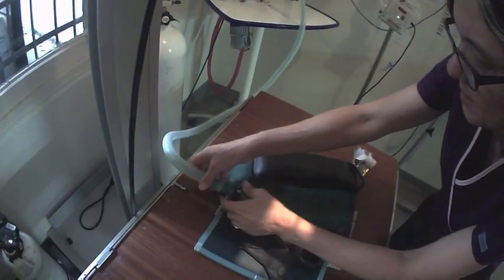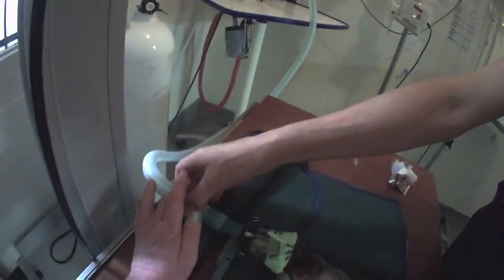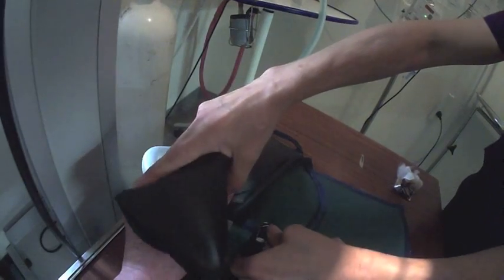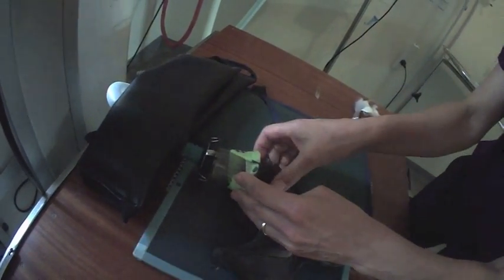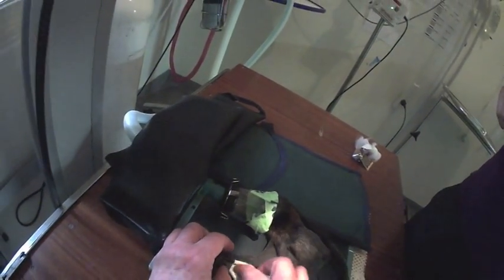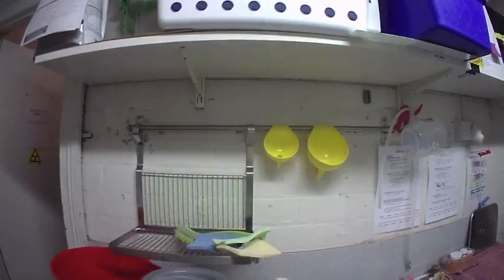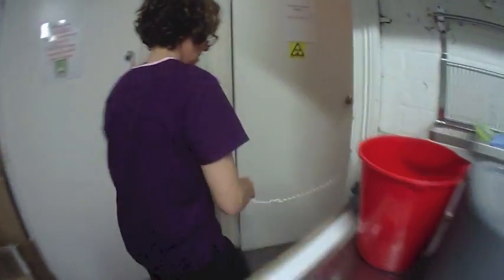I'm going to do that. If I do this, I'll just hold that for one second. That angle might be a little bit better. Little dude. We like callus.